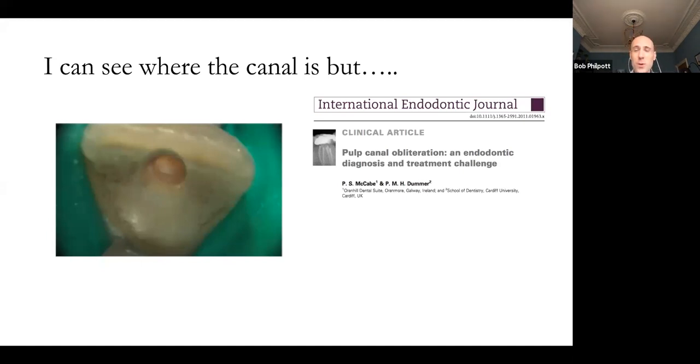question, which is even with the smell that's there, and it is a balancing act, you know, because I'm all about the patient comfort when you're having a root treatment done, because it's unpleasant enough as it is from a patient point of view. But I will kind of alternate, and I will use a common sense approach in relation to that, so that if I do access through and then suddenly it stinks really badly, I will turn the water on and I will just say, I'm going to need to slow down here, and I'm going to need just accept the fact that I'm going to need to keep cleaning my mirror.